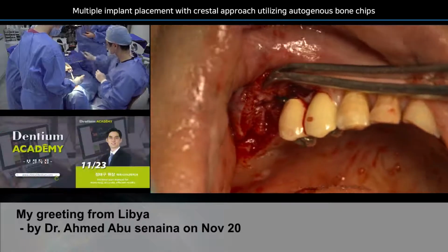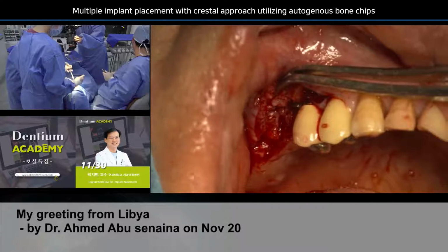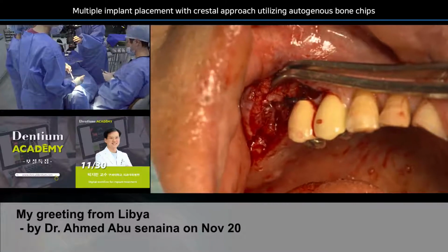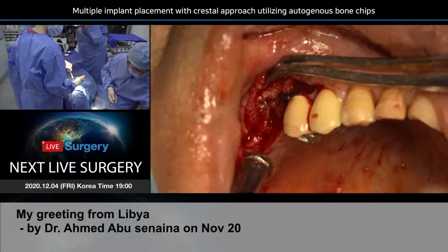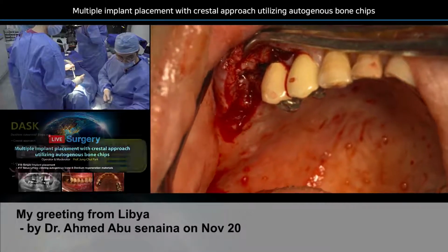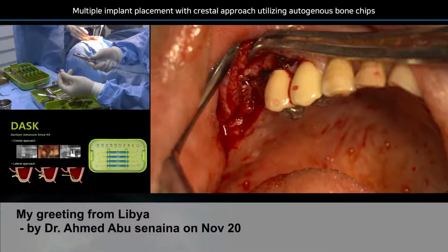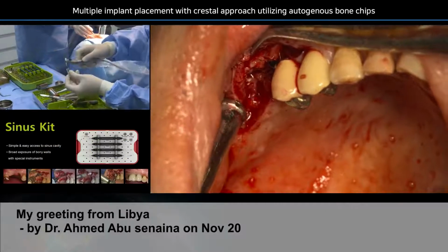Again, this is the handpiece and the program should be properly positioned to program 2 because there will be no high speed rotation and there is no irrigation. And I'm checking this fixture mount again. And this is the final 4.5 and 8 millimeter implant fixture. Removing.